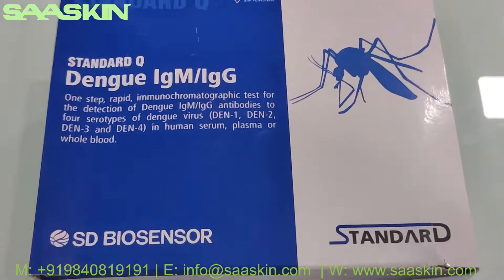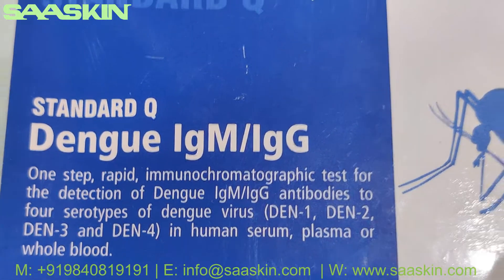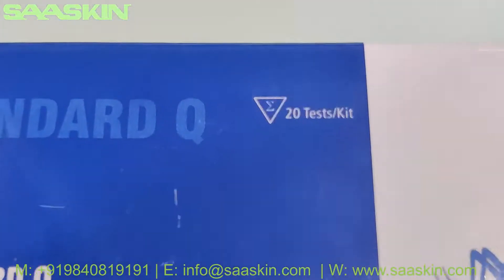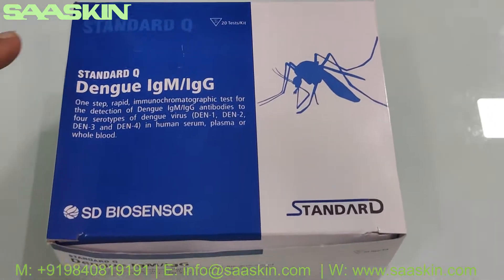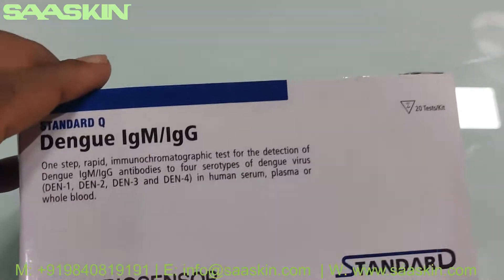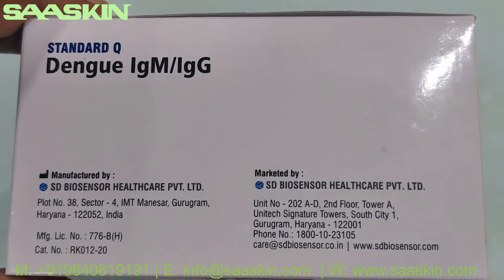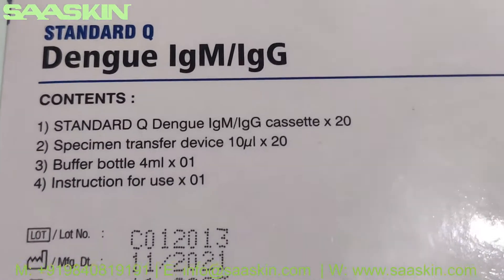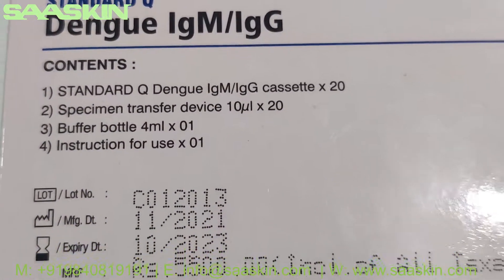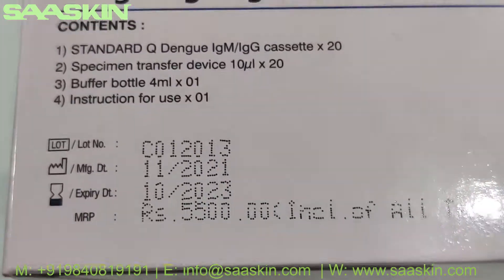Hello everybody. I'm going to unbox the SD Biosensor Standard Q Dengue IgM IgG antibody test kit. This is a 20-test kit box. This is how the box looks like — I'll show you around. This is manufactured by the SD Biosensor Indian plant. You get 20 test cassettes, 20 specimen transfer devices, a buffer bottle, and an instruction for use. The standard expiry period is two years.